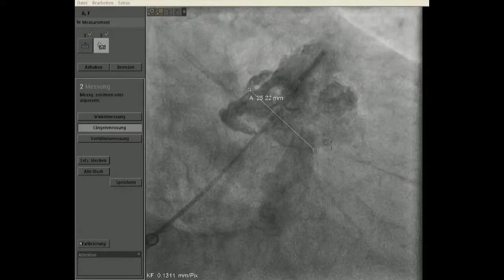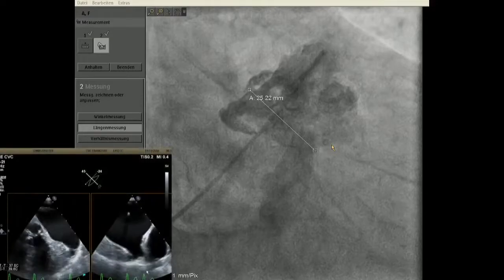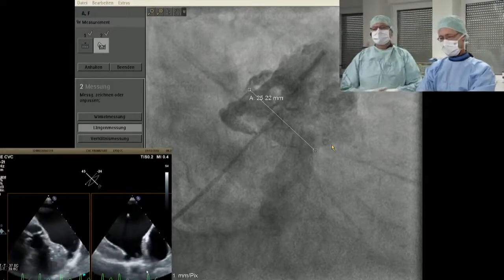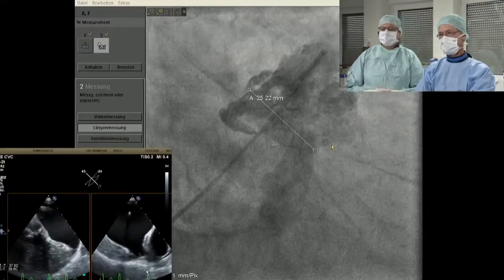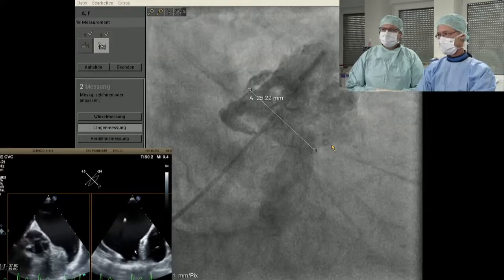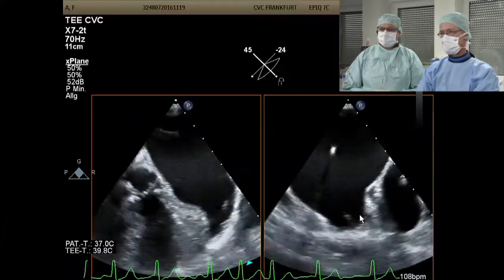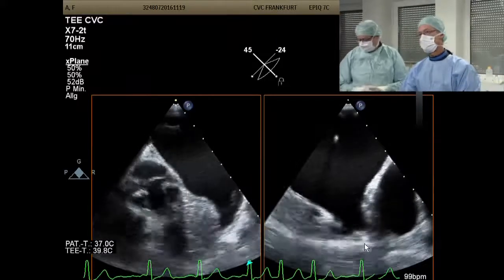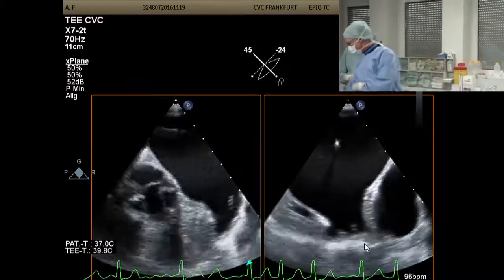And what would you do? I'd probably go with the longest, largest lobe, and try to be more proximal than I would. What numbers did you get in terms of diameter? So the landing zone was 23 millimeters, the widest. This was in the 135 view, the view on your right. And the longest lobe that we could see when we focused on it was the anterior lobe, which is about 24 millimeters. So I would go with the anterior lobe.